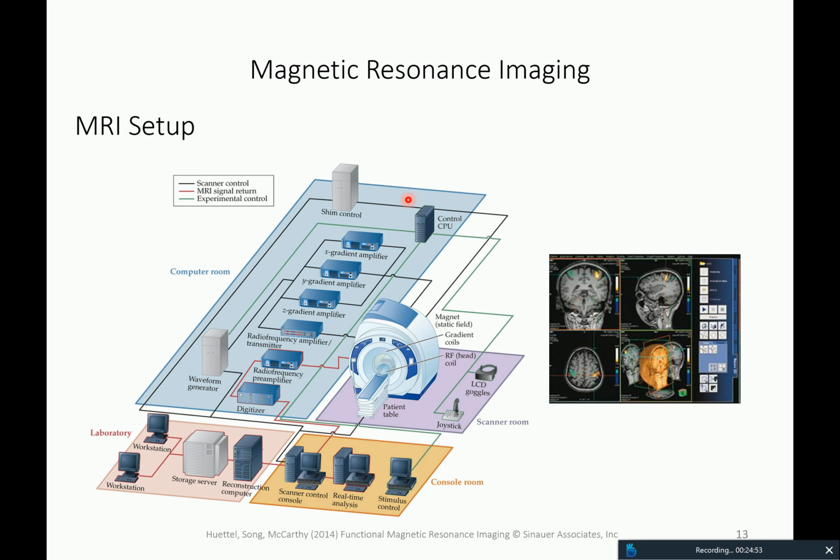Actually, the way this really works is if the scanner is not working. The way MRI works at a university is that there's the MR center. You need to buy the scanner, and you remember from last Wednesday there were some pictures of when the scanner arrived. Then there's a contract with the company, in this case Siemens, who do the maintenance.